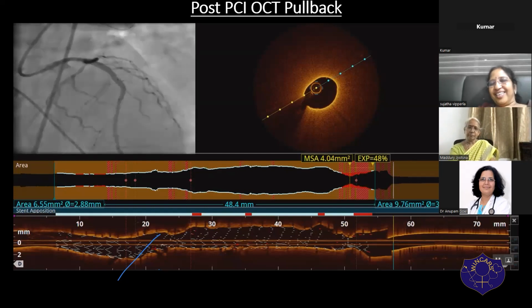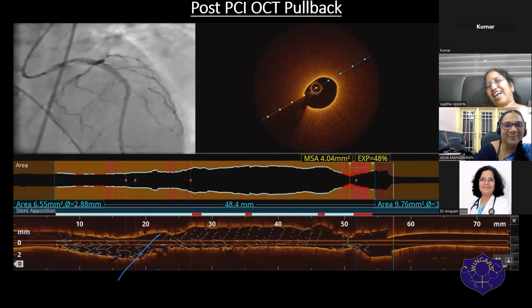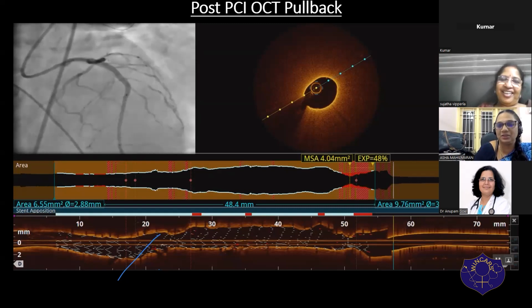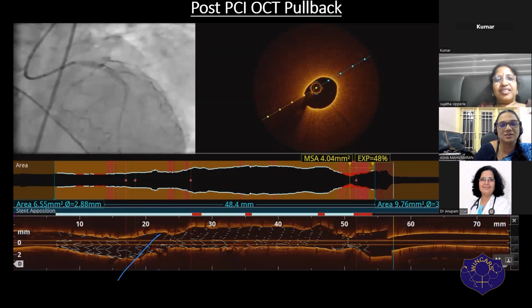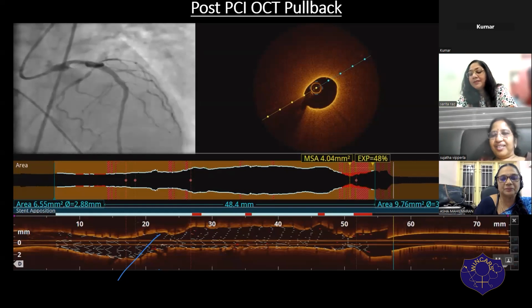You know, but angiographically, it actually looks not overexpanded. Angiogram, Asha, in that calcium. I know, that's what I'm saying. If you've not done imaging, you will think that you've done an extraordinarily good job and you would have walked out. So imaging really makes a difference in these lesions. Because I need to understand angiographically. Perfect, Dr. Asha has hit the nail on the head.